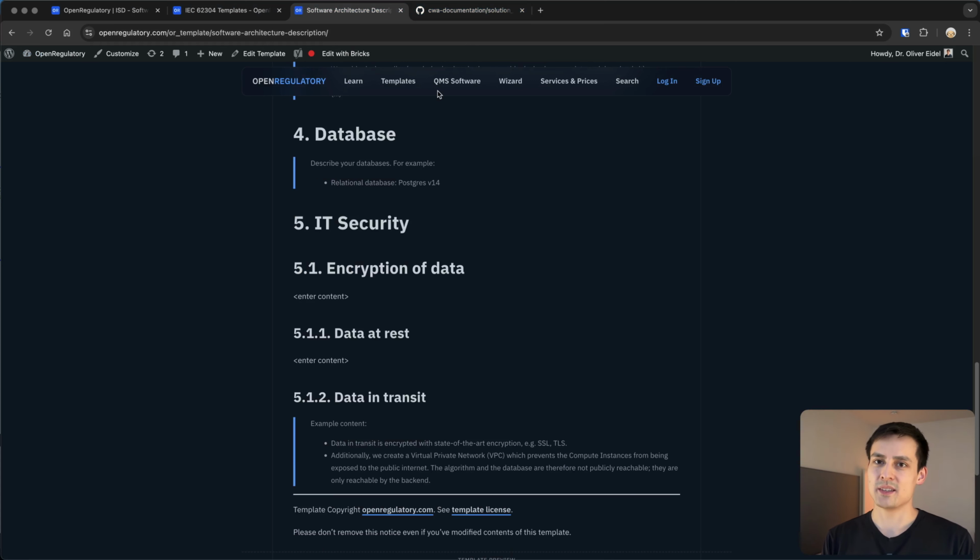And again, maybe as a quick side note, one big question always is, how much of this do you do for being useful for your day-to-day development work? Do you really create this documentation to share among developers? Or do you only do it for regulatory compliance? There are very different ways of seeing this and very different opinions there.